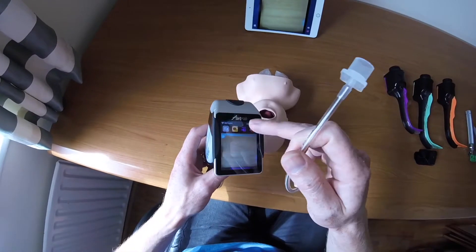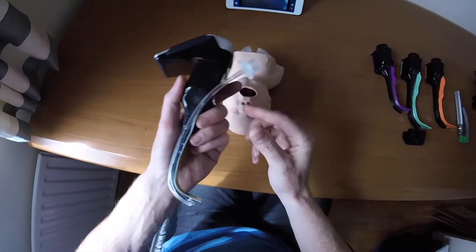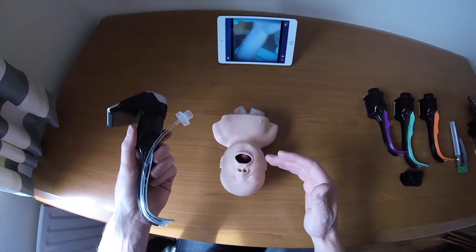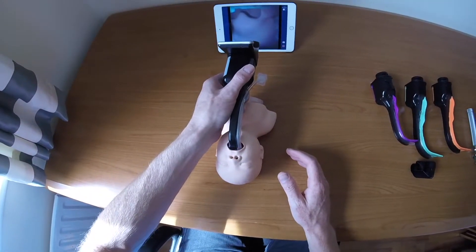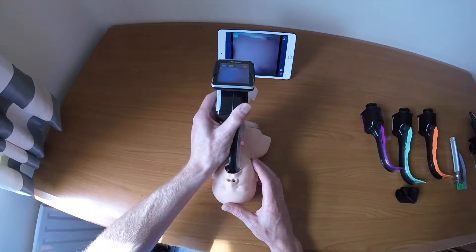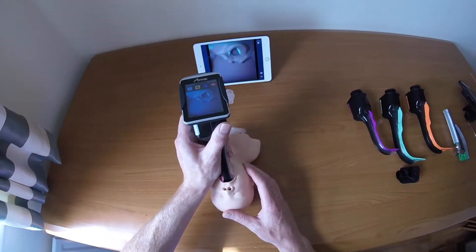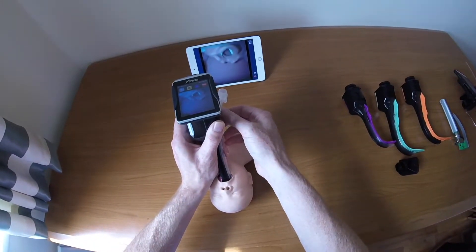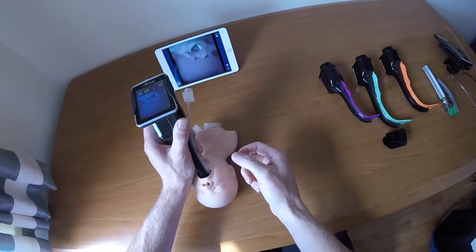Now for the intubation technique. Insert the Airtrack in the midline and over the top of the tongue, starting horizontal, dropping it into the patient's mouth, then angling it around the corner. You want the airway centred in the middle of the screen but also in the top half. To check alignment, advance the endotracheal tube very slightly to see the direction it will travel out of the channel.